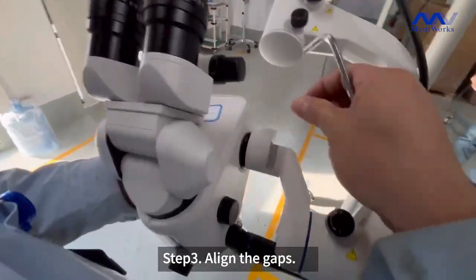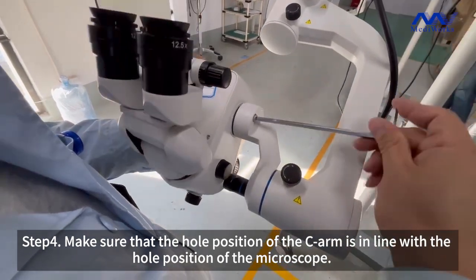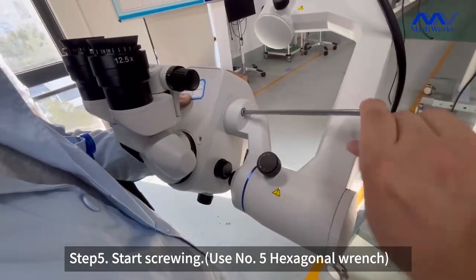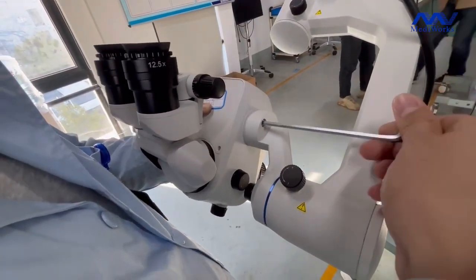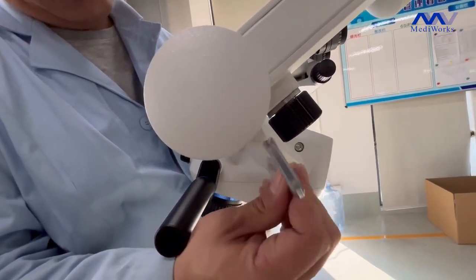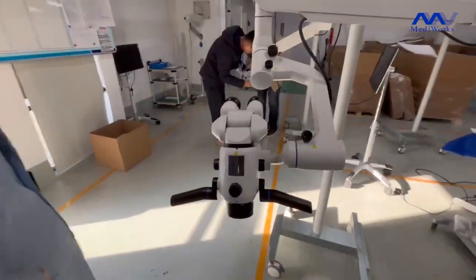Next we should align the gaps. Make sure that the hole position of the C-arm is in line with the hole position of the microscope. Then we can begin to screw. It's done. Good job.